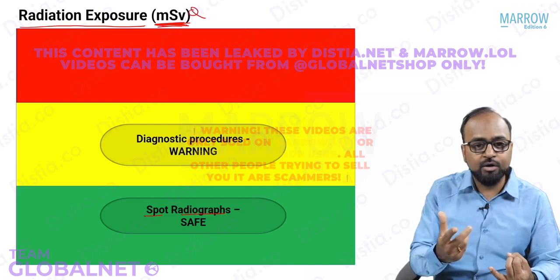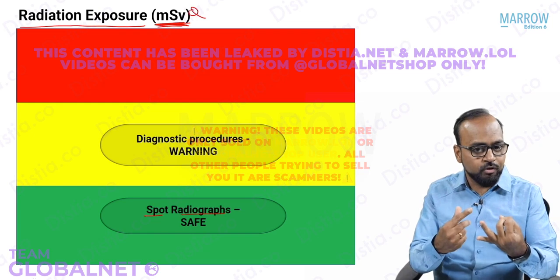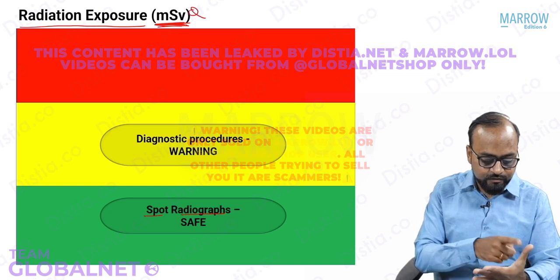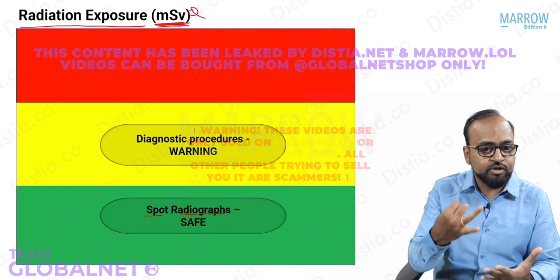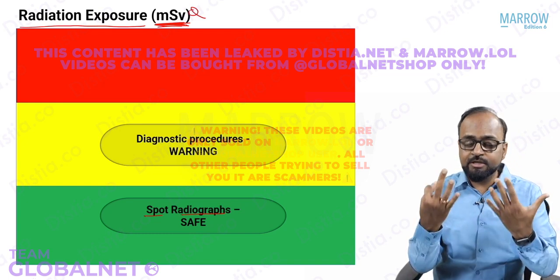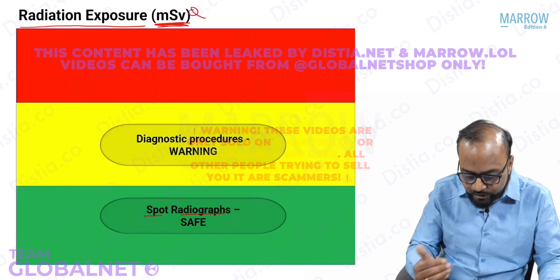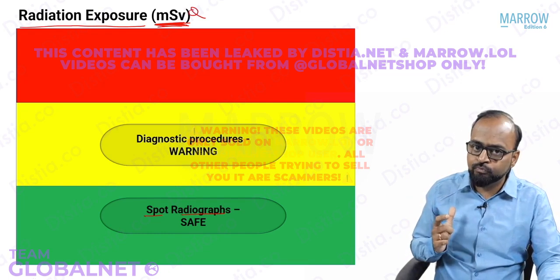We follow this. How do we do it? So, plain film, 0-minute film at injection of contrast. Then we want to trace this contrast as it comes into the kidney and opacifies the kidney. So 5 minutes, 10 minutes, 15 minutes, 30 minutes, full bladder at 1 hour. Then we ask the patient to void urine and then again post-void. How many times is the patient exposed to X-rays? Multiple times, isn't it? So radiation exposure is going to be logically high. So therefore, diagnostic procedures are in the warning zone or yellow zone.